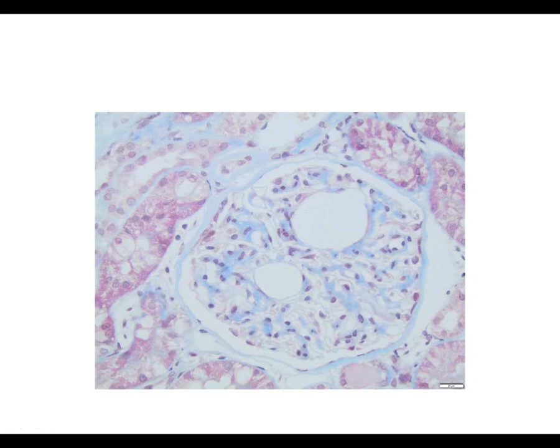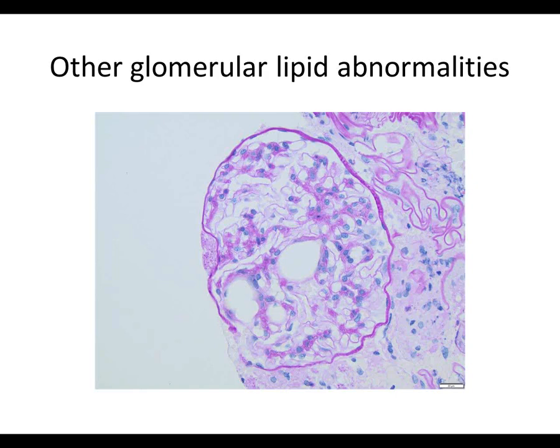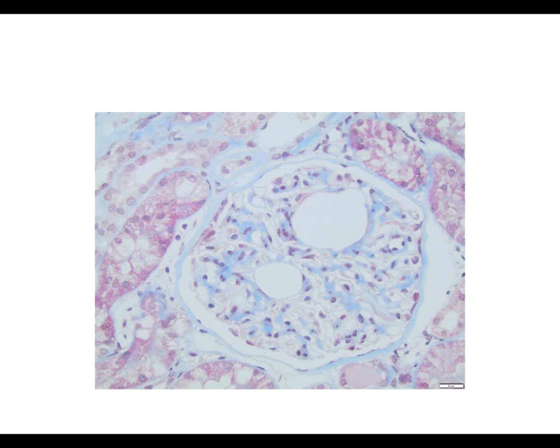So the question here is, do these miniature schnauzers have hyperlipidemia? It's not as severe as some of the miniature schnauzers that we see. We actually have a geneticist at University of Minnesota who is helping characterize these miniature schnauzers, doing some gene sequencing for some of the APO alleles. So we're trying to figure out what the genetic abnormality is. They are hyperlipidemic, but they are not severely hyperlipidemic like we see in some of the really severe cases of miniature schnauzers. So anyway, if you see a big, huge, open, clear space in the lumen of a capillary, check and see if it's a miniature schnauzer.